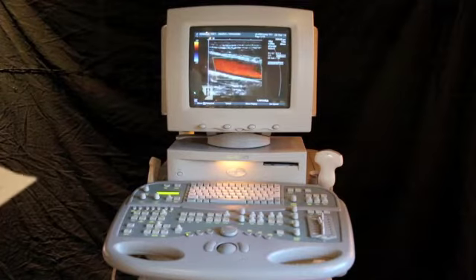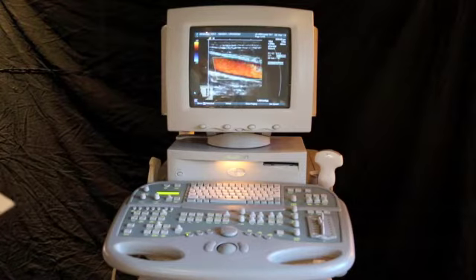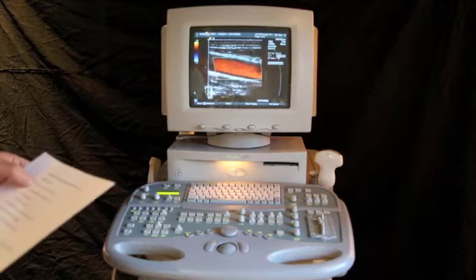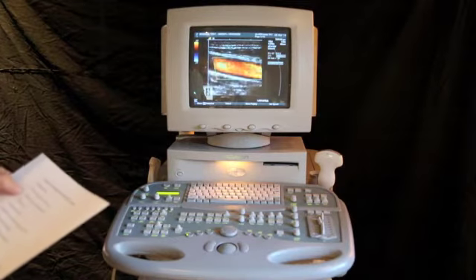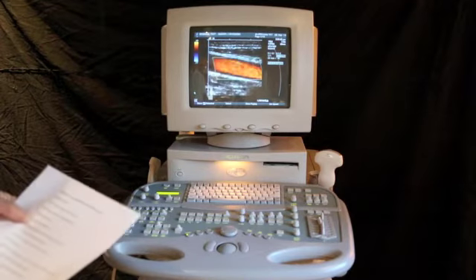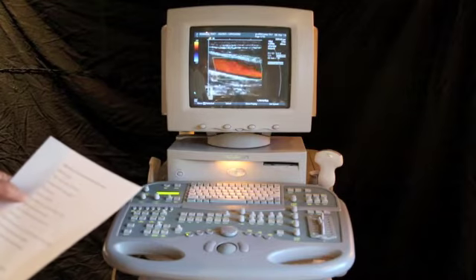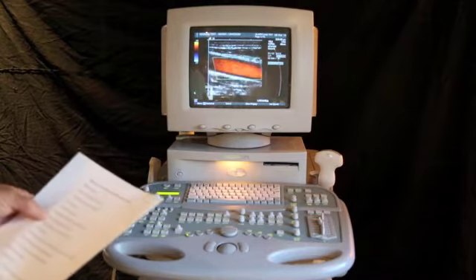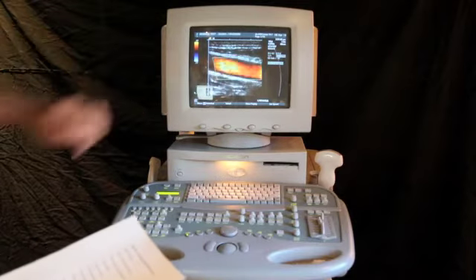Today we're going to take a look at the Sequoia C512 shared system sitting at software revision 12.221, very stable software release. This system has a CRT monitor, NTSC video, it does cardiology imaging, OB calcs, and vascular calcs. So it's a very versatile machine. It has customizable annotations as well as customizable imaging presets. It also has native tissue harmonic imaging. It has a built-in workstation which allows you to look at the images like we are at the moment.